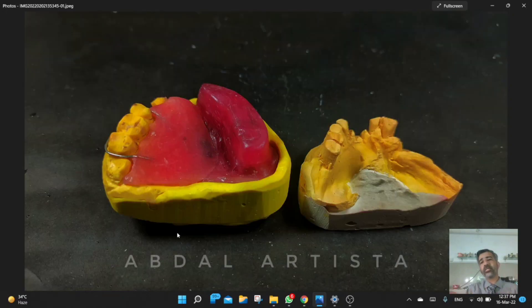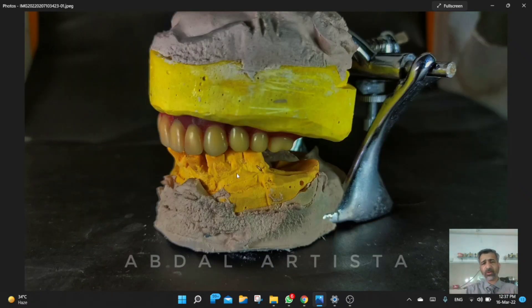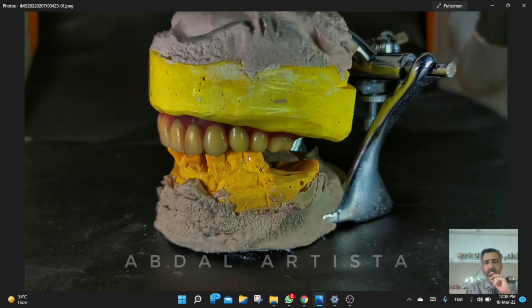We took the jaw relation and when it came to the lab we articulated on the articulator and did the wax setup accordingly. In this situation we had not done spot grinding first. We decided it should be done at the time of insertion, as we felt the jaw relation recorded might not be 100% exact.